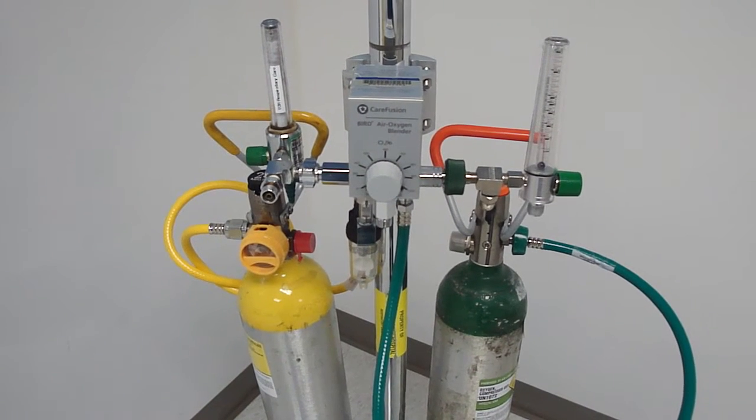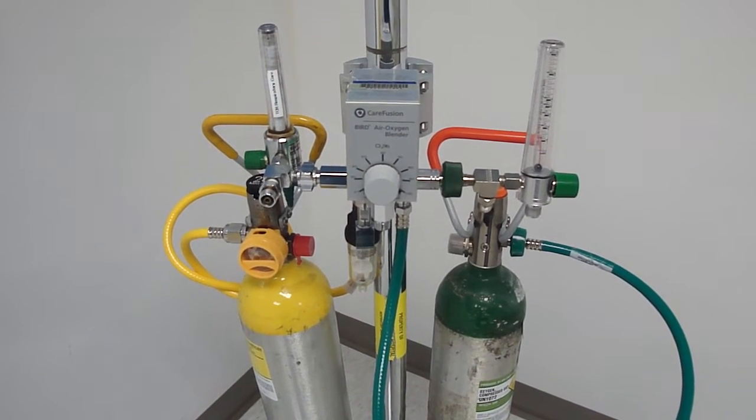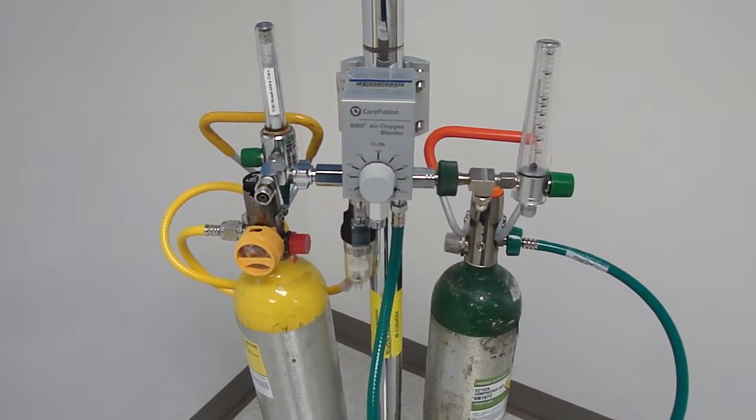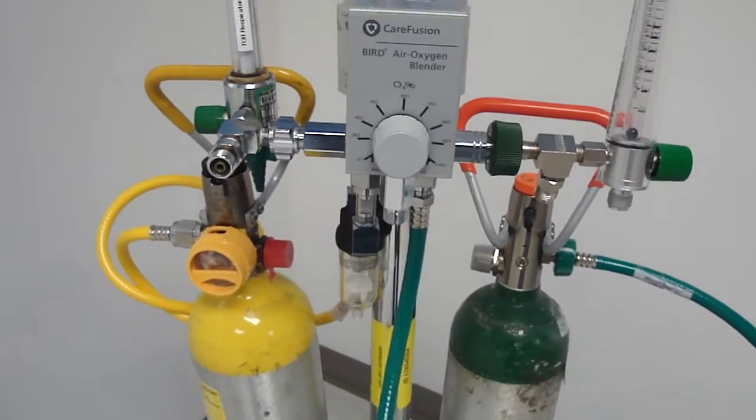You're going to have an oxygen cylinder, which is the green, and an air cylinder, which is the yellow. Both of them are connected with high pressure hose to the blender itself.